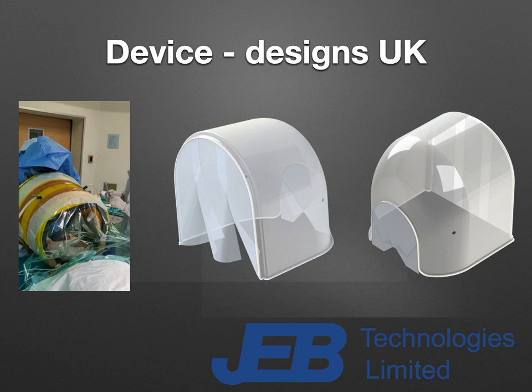Both ends are covered with a clear draping. It is not an enclosed area, and this facilitates the air change rate, because if we enclose it with a solid partition, then the air change rate will get affected. Also, the larger opening provides very good access to the operator. The operator is obviously in PPE, but his hands are not stuck through holes, like handcuffed hands. Anesthetists should have freedom to move their hands because they should be ready to tackle all sorts of emergencies.